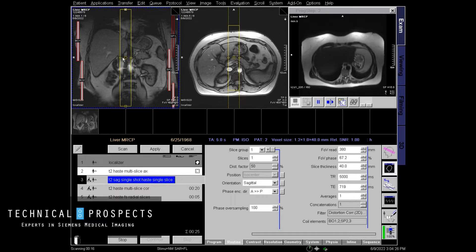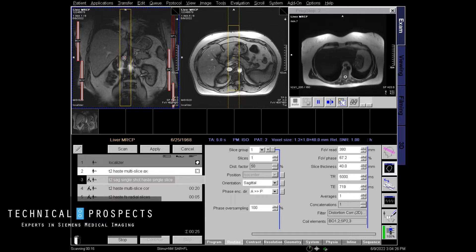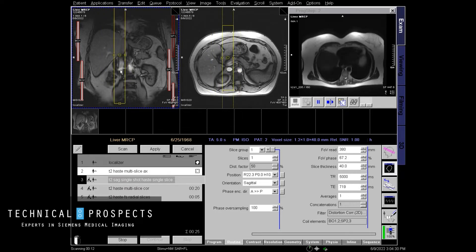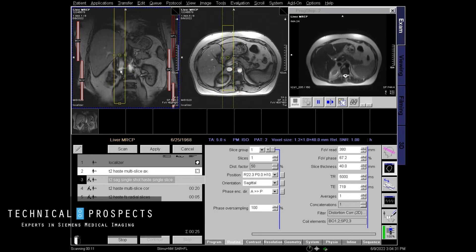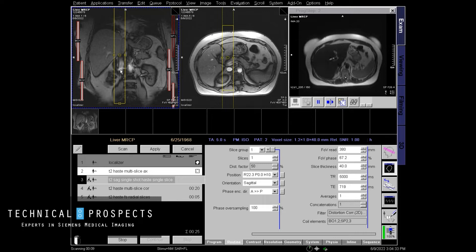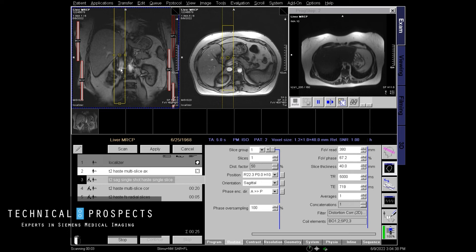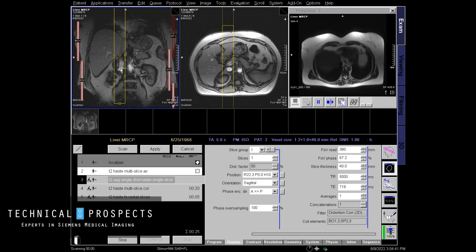Next, I personally like to run a sagittal single shot, single slice HASTE. Why? Because your biliary tree typically, sagittally, has an angle anteriorly.